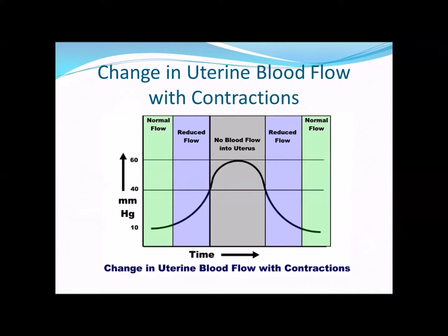But if we've got any kind of pre-existing condition, preeclampsia, gestational hypertension, or gestational diabetes, we're not in an optimal state, and that's where just 1 or 2 contractions can cause a poor tracing. That's why we've got to know the baby, and know the full picture about mom. It's important to remember that although mom's in labor, we still have 2 entities that we're treating.